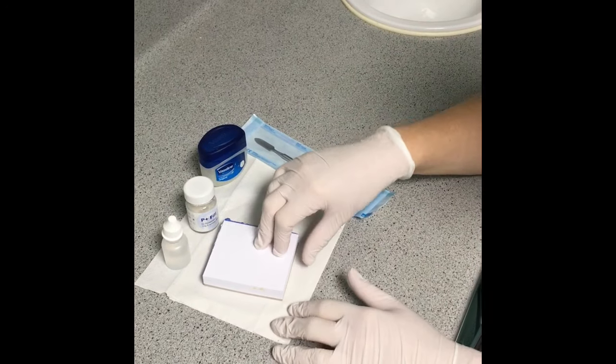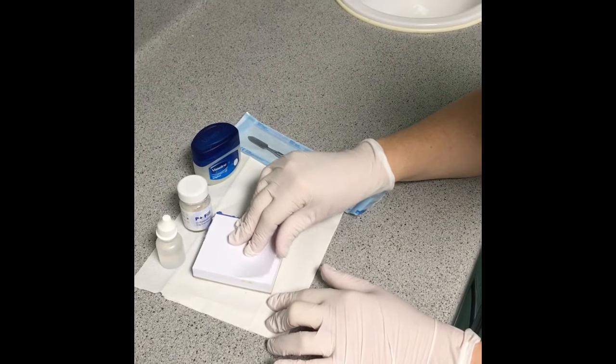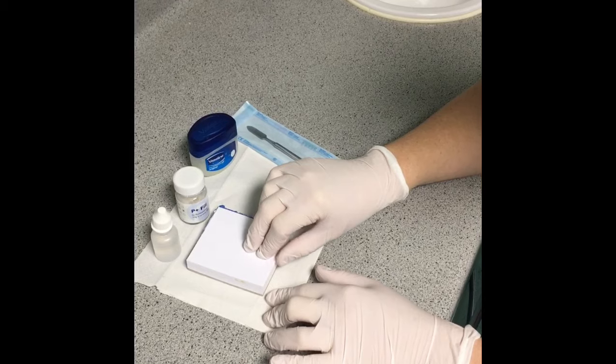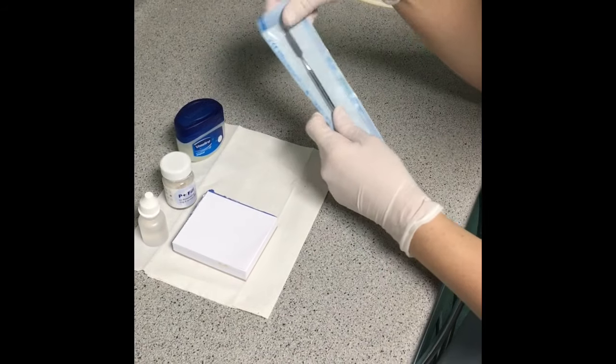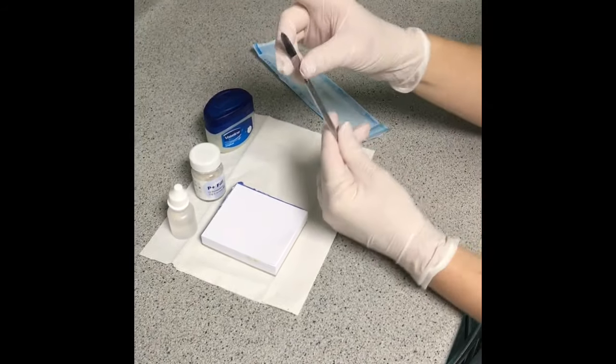or a glass slab. I normally prefer a glass slab, but with the pad you can just take it off and put it in the bin afterwards. You need a spatula. With the spatula, first of all, you mix with the pointy end and then the flat end is for segregating the powder.